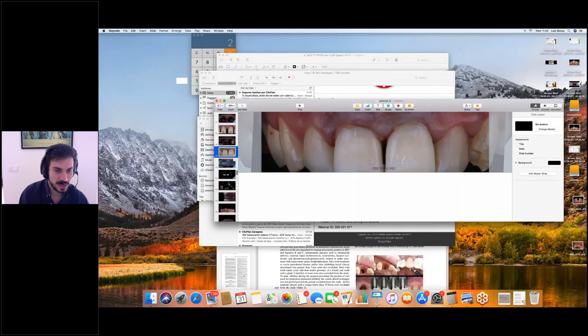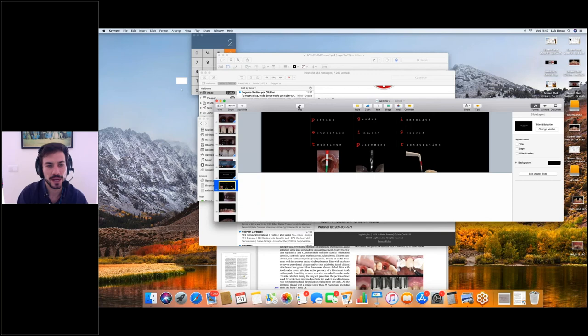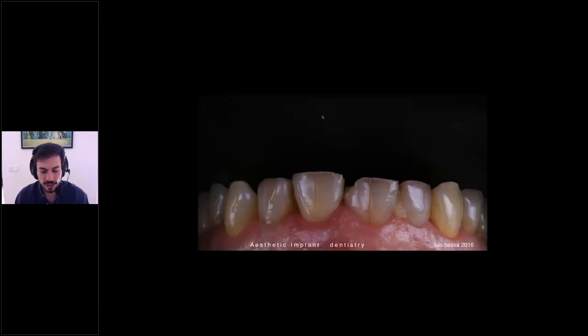So now I'm showing the last case, a guided case performed on one central. This is one of my older cases in the aesthetic zone. So I did a partial extraction technique. I performed a socket shield technique with guided implant placement from TRI implants, and I did an immediate screw restoration and then a copy of this immediate screw restoration.